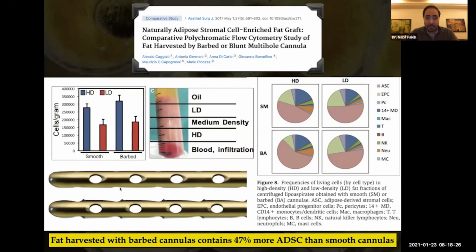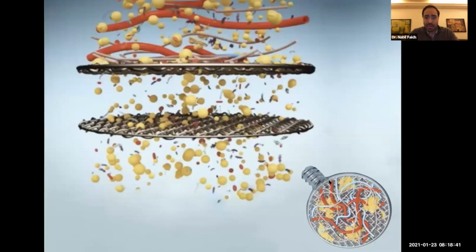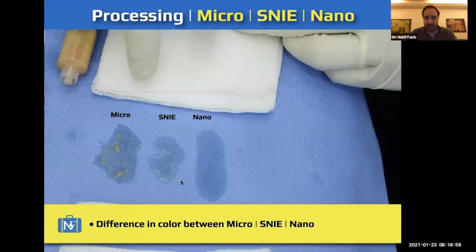So that's why in my master phase set, I have used the tulip harvester, which is really my favorite harvester for doing fat grafting, microfat and nanofat. Whenever we use this separator that has the nanofat, all the fat cells coming from here will get stuck in these two filters, and only the adipose-derived stem cells go down with other substances. But we will not have any fat cells inside.